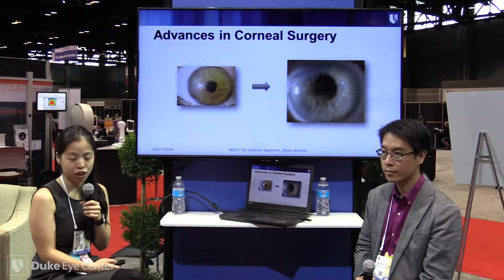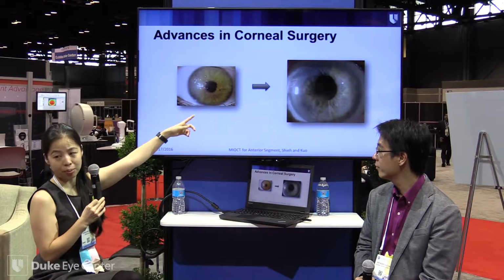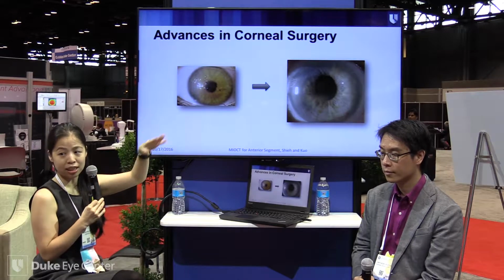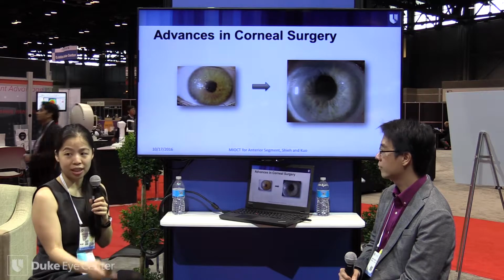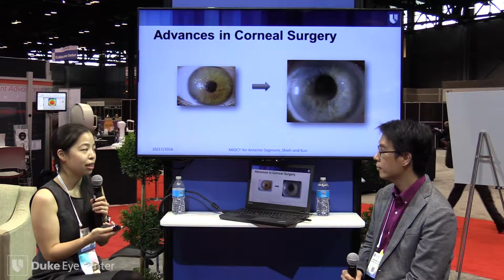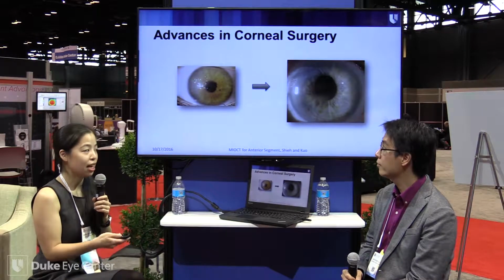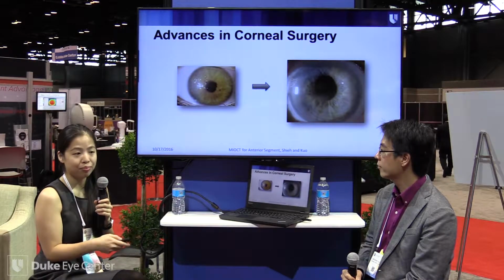We're fortunate with the advances in corneal surgery that we're able to become increasingly sophisticated in how we target the area of pathology. This picture here of a patient with pseudophakic bullous keratopathy, or disease of the endothelium, the inner lining of the cornea, is now able to have, instead of a full thickness cornea transplant, a lamellar or partial thickness cornea transplant, thereby enabling the patient to have faster visual rehabilitation and, as much of the literature suggests, potentially lower rates of rejection.